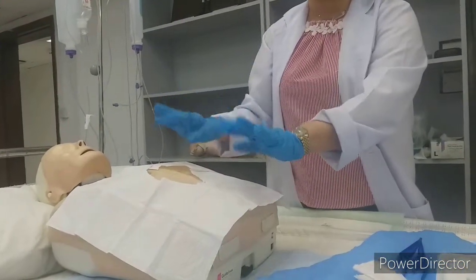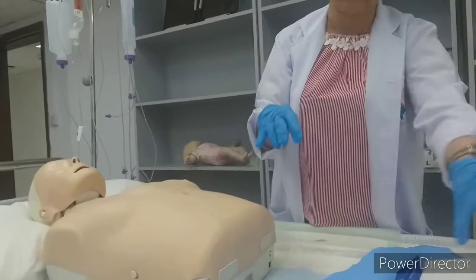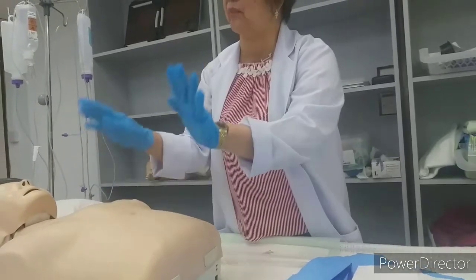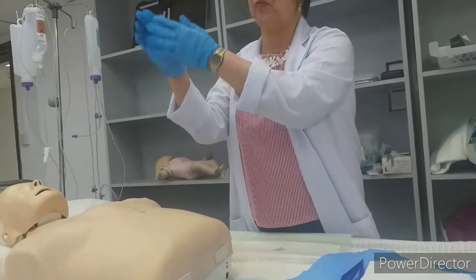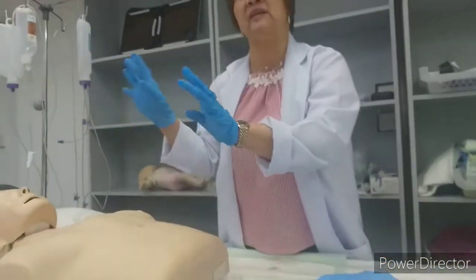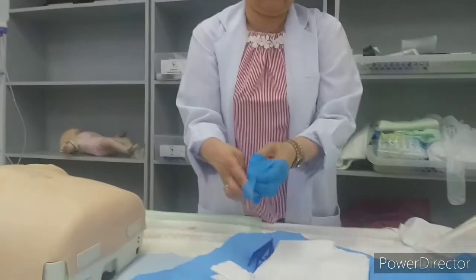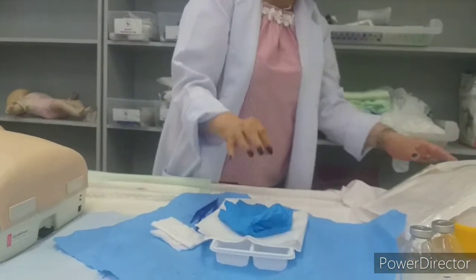Now, so we are done, we will just be removing this. Keep it inside, in the middle of this field. If you are comfortable to plaster, to put the adhesive, you can do it. But I'm not comfortable either because, anyway, the patient is okay. Patient is not infected. So I will just take off my glove, clasp it, so hold it this way to the receptacle.